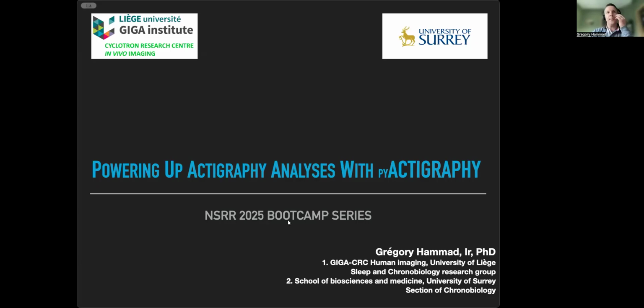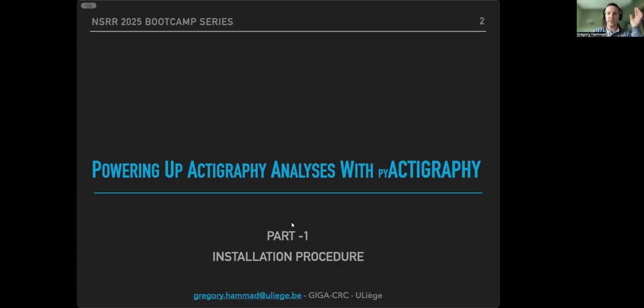So now, if you allow me, let me share those slides. Okay, so this is going to be the presentation, and you received the timetable prior to the webinar. Normally, I should be giving a quick overview of the current use of actigraphy in sleep and chronobiology research, but what I will do right now is postpone that part and directly jump to the installation procedure, because some people still need to set up the whole environment, and it might take some time. If things are downloading or installing, we can still move on while it's done in the background. So let's move with that.